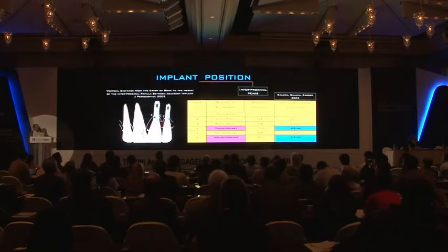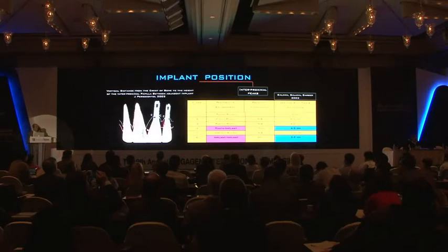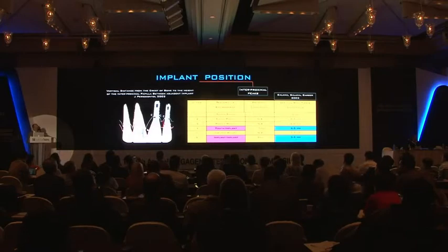We have a second chance at a clinical level if you use a biological connection. We can insert the implant closer than 3 millimeters from one another, as the literature advises us, even though we don't have the loss of the peak of the inter-implant bone because we don't have the resorption cone.